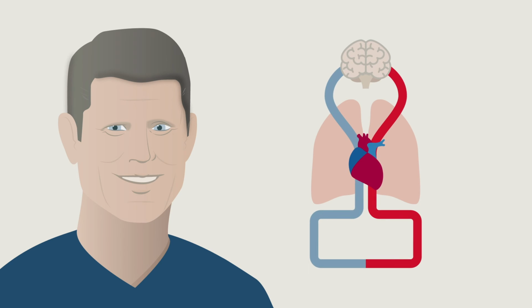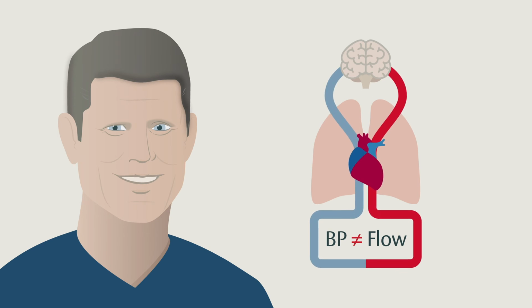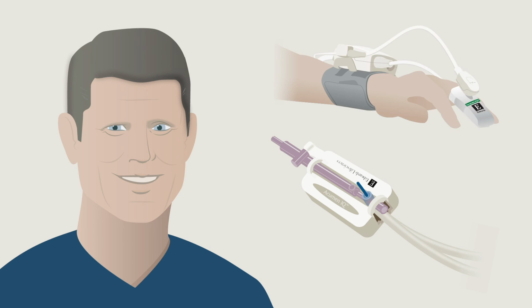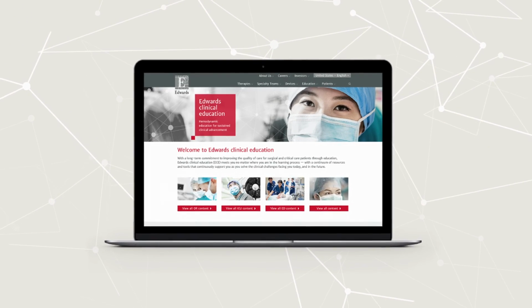If you're with me so far, you recognize that blood pressure measurement is logical to perform and important to do, but that not all blood pressure measurements indicate normal flow states, normal hemodynamics. Logically, blood pressure, cardiac output, and the determinants of cardiac output, including SVR, should be measured continuously to avoid hypotensive episodes and provide a more comprehensive understanding of flow to vital organs. Doing so through either arterial-based or non-invasive monitoring will help us make the best decisions to care for our patients' hemodynamics.